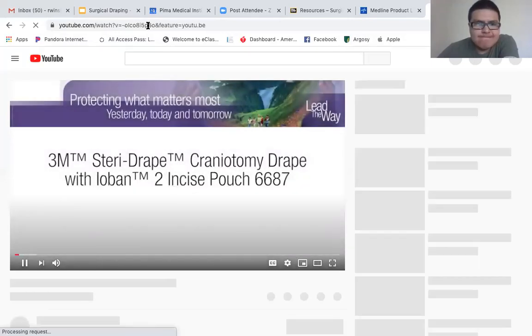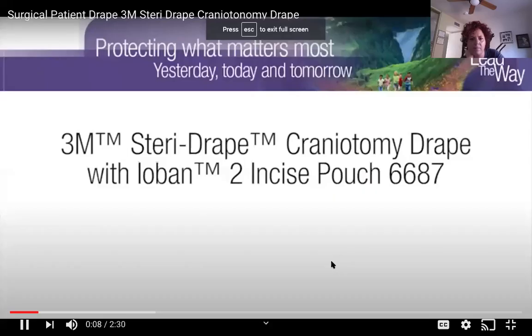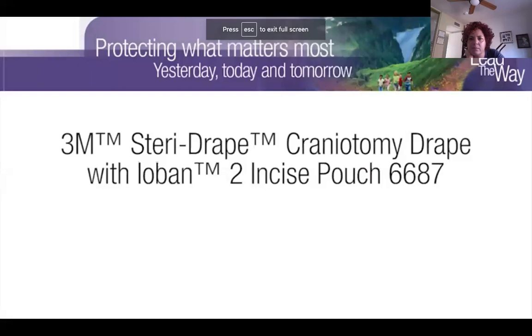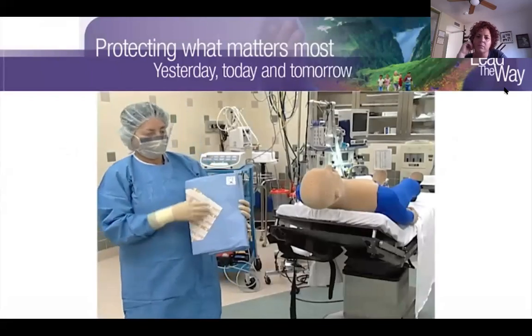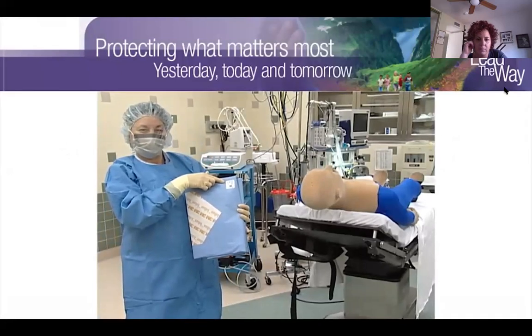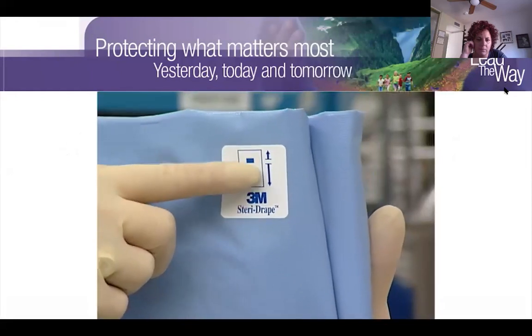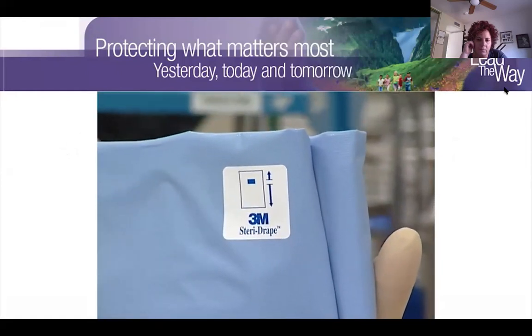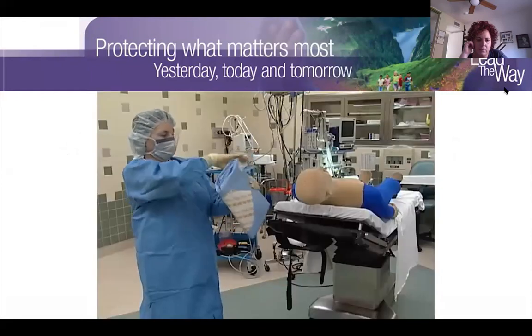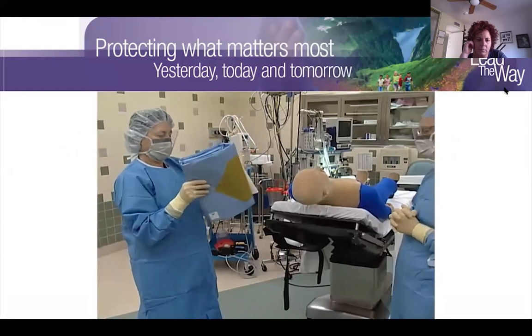In this procedure, we are going to use only one drape, the 6687. The SteriDrape 6687 one-piece craniotomy drape contains all the pieces needed for complete draping of the entire patient. The sticker on the 6687 one-piece craniotomy drape shows you where the head of the patient should be located and how the drape should be positioned. The arrows show the short and long ends of the drape. The short end goes to the head, and the longer end covers the entire body to the foot of the bed. Holding the drape with the shorter arrow of the directional sticker pointed to the head, remove the Ioban incise liner.